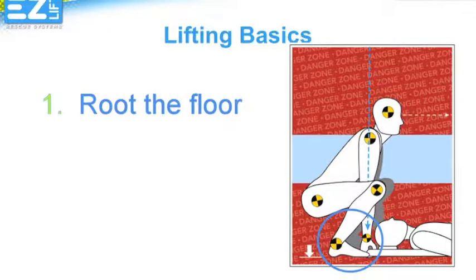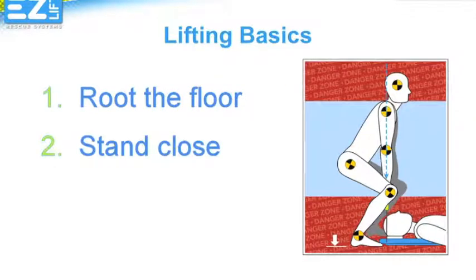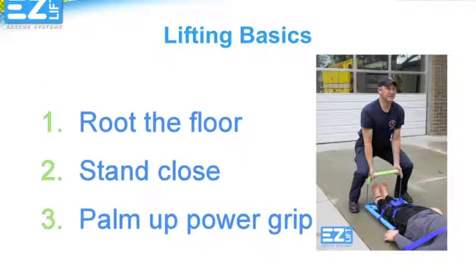There are times when we just don't want to get close to that guy on our backboard, but for you and your partner to stay safe, you really must stand as close as possible to the object being lifted. In the case of the EasyLift Rescue System, the handle should be between your knees. For a traditional spine board, your grip should be between your feet. We suggest a Palm Up Grip no matter what kind of spine board you are lifting. This is called the Power Grip because it helps you keep your shoulders back and your back straight.